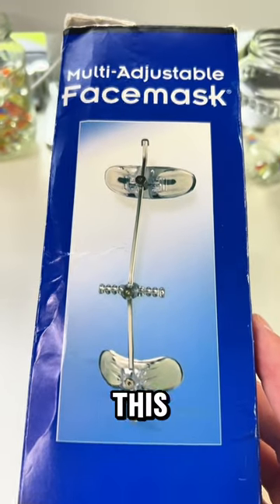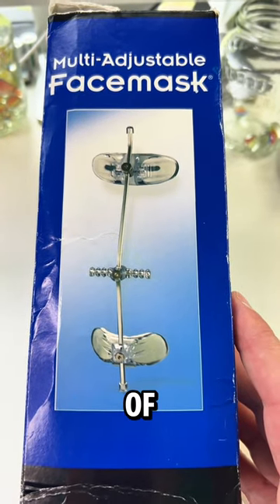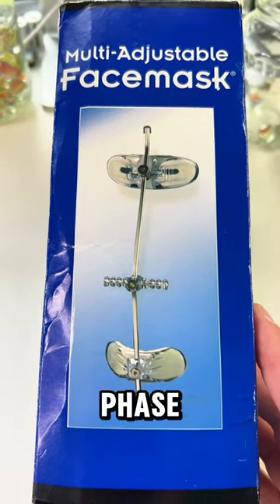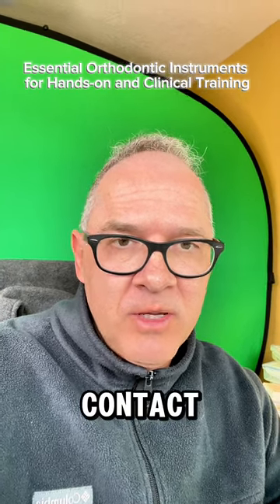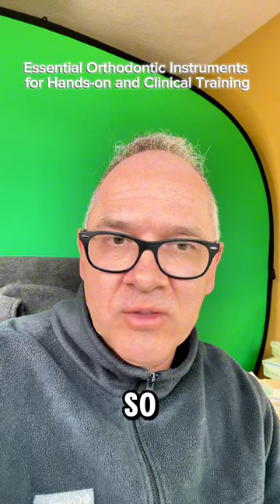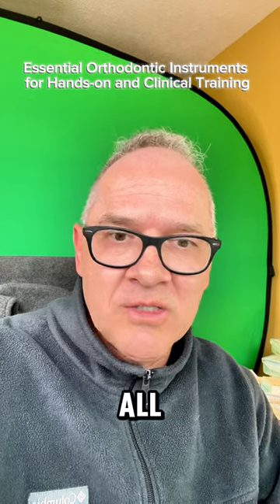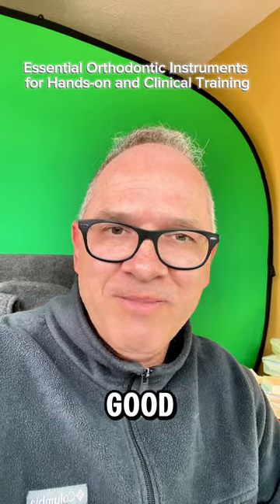I would also get a face mask — this is for Class III patient treatment in Phase 1 orthodontics. If you're going to be treating a lot of kids who are Class III, you'll be using this quite a bit for children in Phase 1. These are basically all the instruments you would need for the hands-on section for any of our courses. You can share them between students — contact OrthoArch or any company. If you get these instruments, you'll be able to practice all the hands-on sections in our assisting course, mini residency, or any of the hands-on practice sessions. Have a good day!